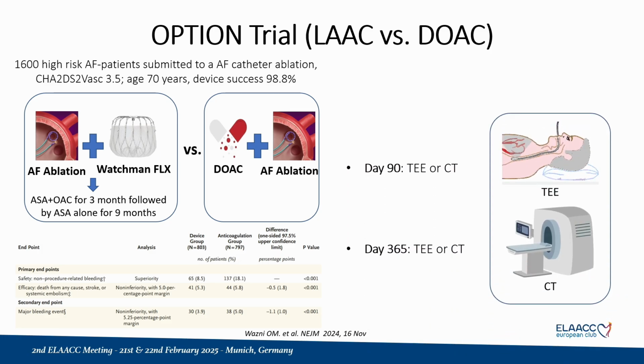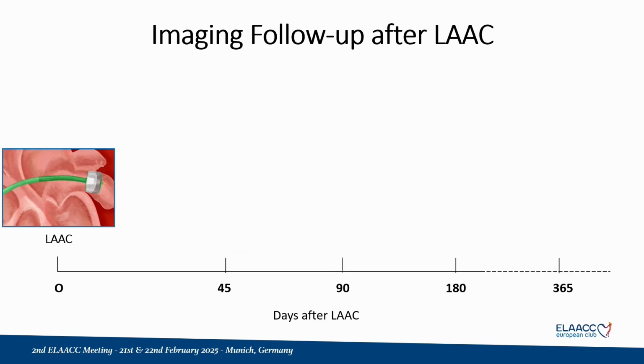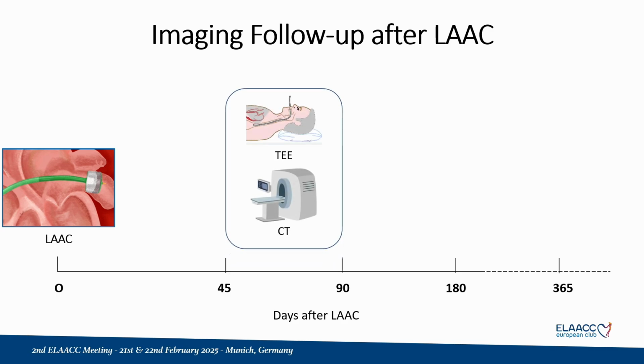This trial had in the study protocol included a TEE or CT at 3 months and a TEE or CT repeated at 1 year. So, based on these 2 trials, we should perform a TEE or CT imaging follow-up between 1.5 months and 3 months.